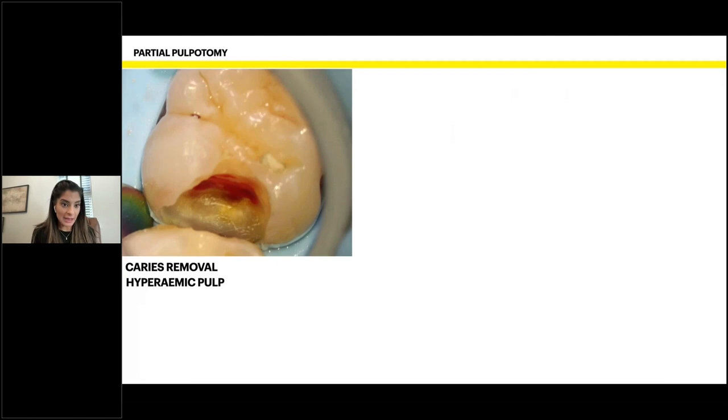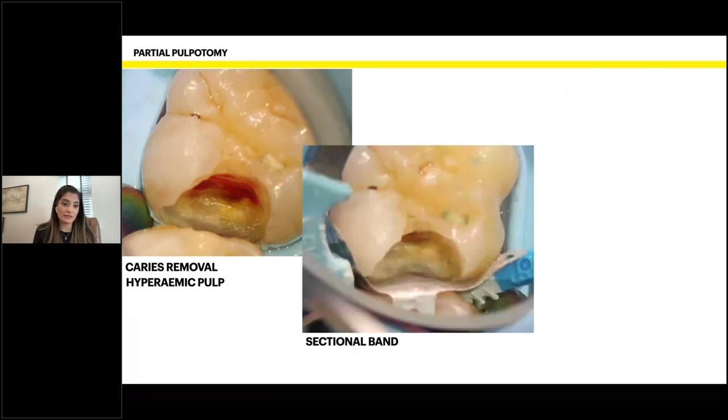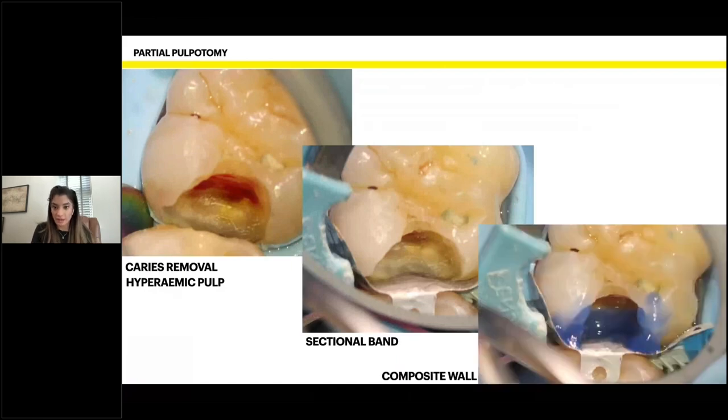So first thing I did was rubber dam, and I removed the temporary filling and the remaining caries, and you can see here, the pulp was hyperemic. I was keen to treat this in one visit if I could, because the patient had come from quite a long distance. But in this case, you can see it's very complex because I'm going to try and now build up my external wall, having had an exposure of the pulp. Now, fortunately, the pulp here stopped bleeding, so I etched and bonded the wall and placed a composite restoration.